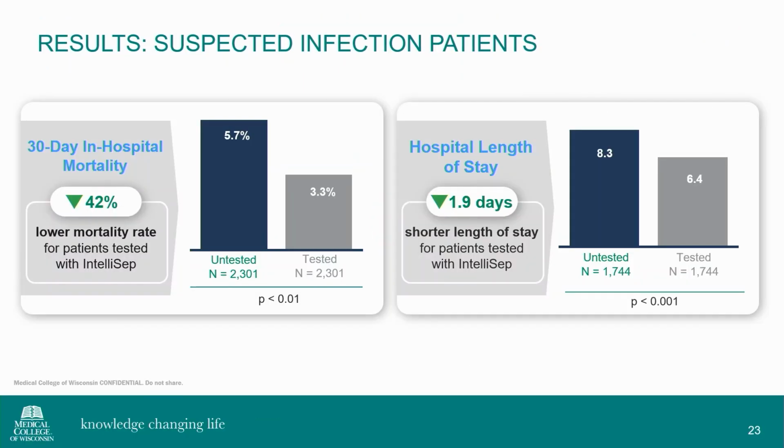So we set out to utilize this test at Freighter Hospital in our emergency room. We initially launched the test and basically said, clinicians, here you go, use the test. We did a fair amount of education to our clinicians on what the test could do, what the individual bands meant. And interestingly, when we went about 9 months and started to take a look at our data, our ED physician group split fairly evenly among those that used the test versus those that didn't.